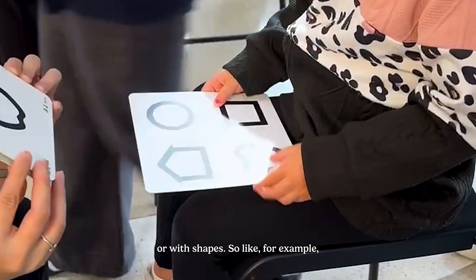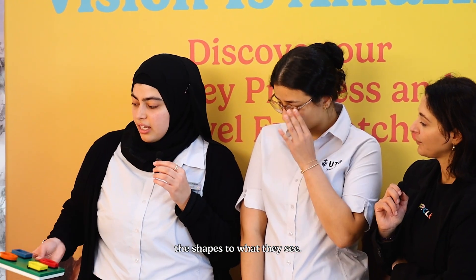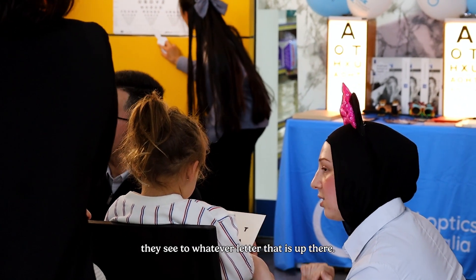For children who are usually four years or younger, we usually test them by matching with shapes. So for example, we can just match the shapes to what they see. We can always do matching with cards, so they can just match whatever letter they see to whatever is up there.